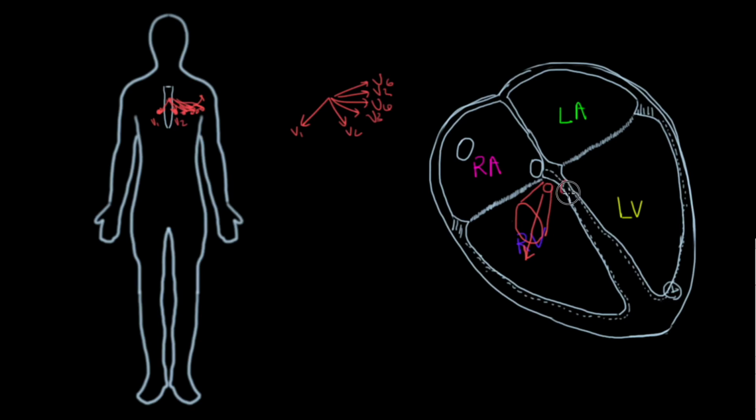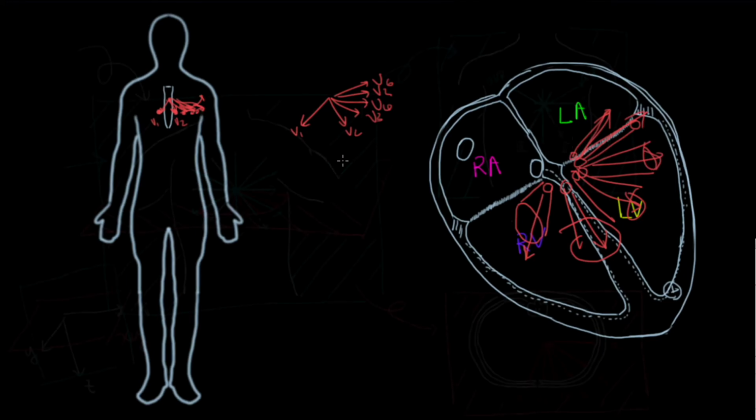So for V1, this is just to illustrate the concept overall. Not necessarily accurate in terms of the dimensions or anything like that, but it's coming out towards you. These ones going more out toward the side. Kind of like that. It's a terrible drawing, but I hope that clears things up a little bit.